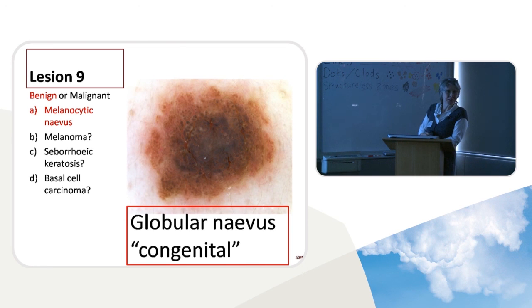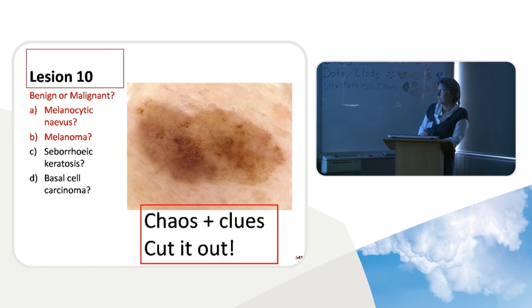It's one of those bumpy papillomatous nevi. We're seeing basically a symmetry of structure. So it might be ugly, but it has symmetry. Congenital nevus. This one?